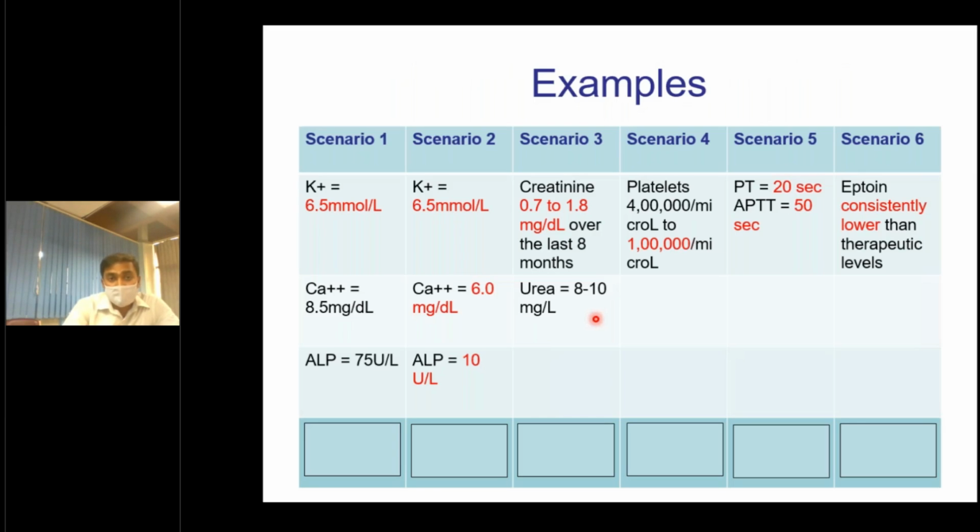So if I go back to the scenario which I had initially shown, the first scenario, you can see that there is hemolysis. This is commonly found in your reports as a comment that hemolysis is there, mild or moderate.